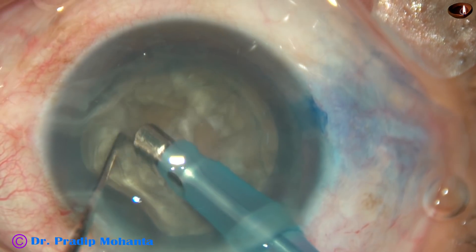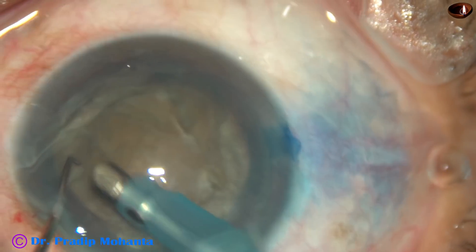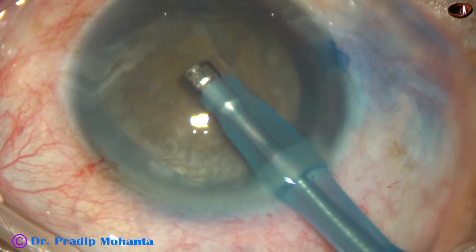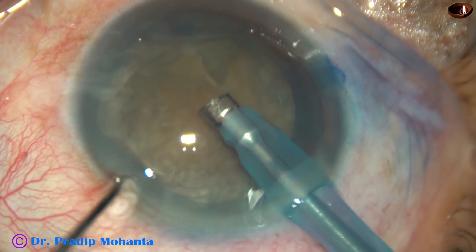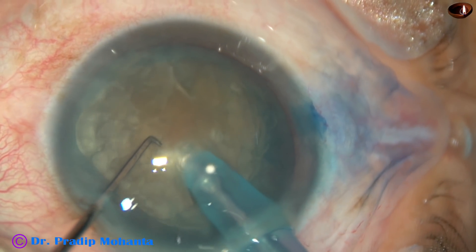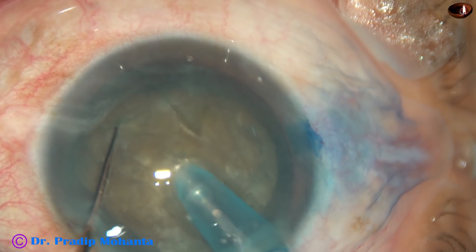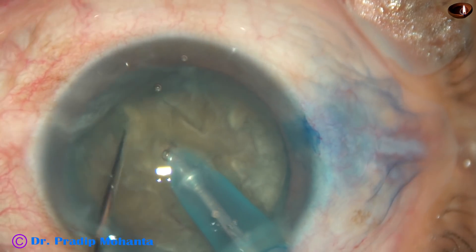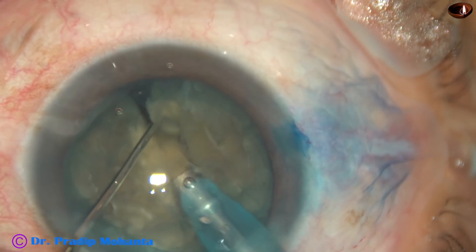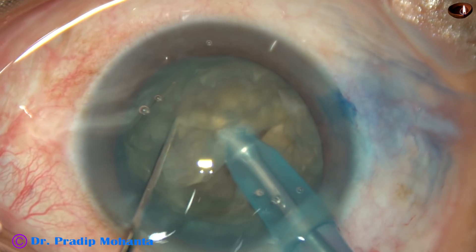And now, the tip of the phaco handpiece is introduced into the anterior chamber. Some superficial cortical lens matter is removed. And now, this is submarine chop. The lens is pushed a little down, and the tip goes into the substance of the nucleus just in front of the main incision, traveling through the substance of the nucleus towards the opposite equator. The chopper supports the anterior surface of the lens, and as the tip reaches near the opposite equator, the lens is chopped into two halves.